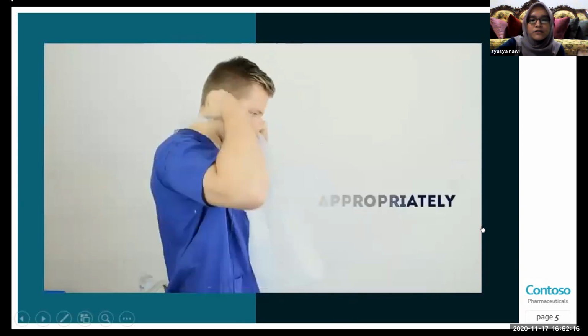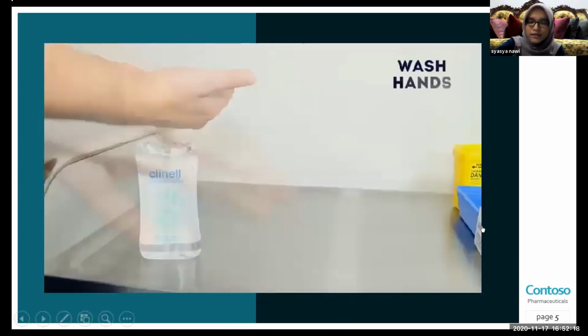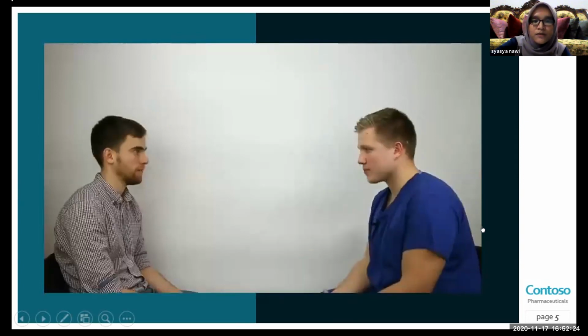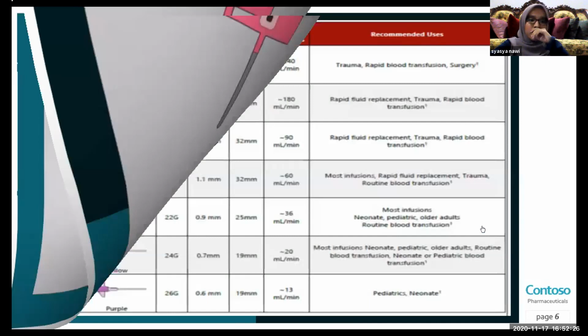After removing the glove and the apron, don't forget to wash the hands. Thank you. Are you feeling okay, patient? Yes, I am. Thank you. Brilliant. Thank you. Okay, that's for intravenous cannulation.